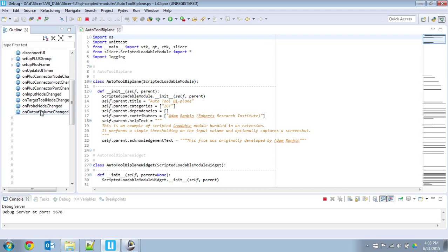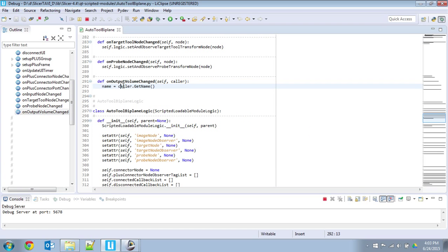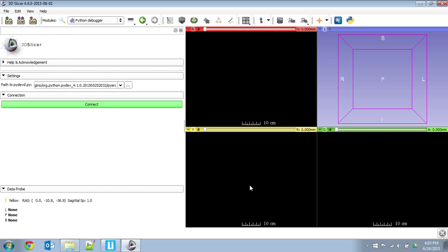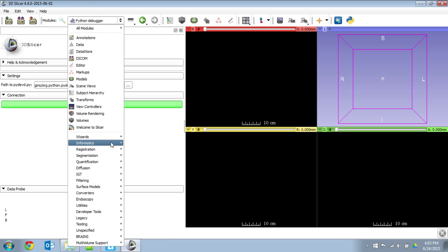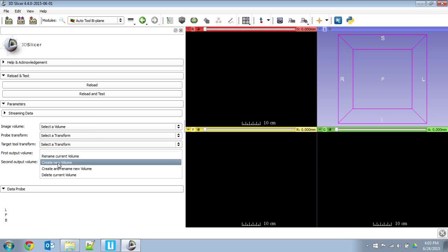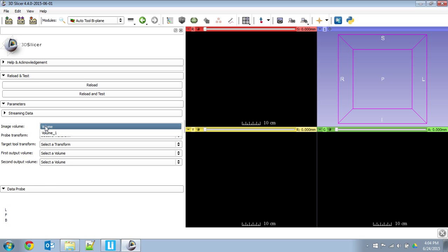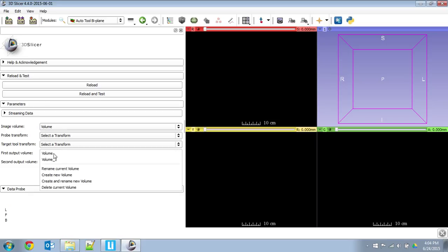So let's watch what happens when we change the output volume. By double clicking on the gray area, I've set a breakpoint. Very cool. And so now I go to Slicer. I go to my Auto Tool Biplane module. And first we need a volume to switch to. Good, so we have a couple of volumes. And I'm going to switch.